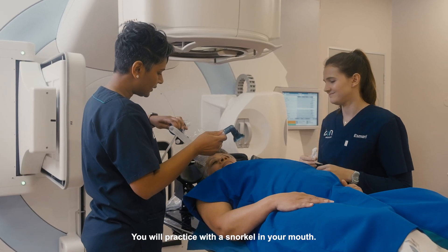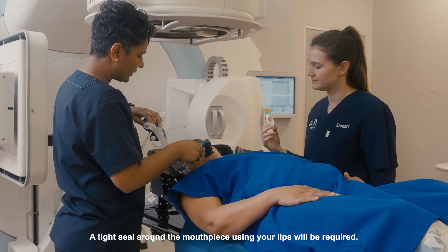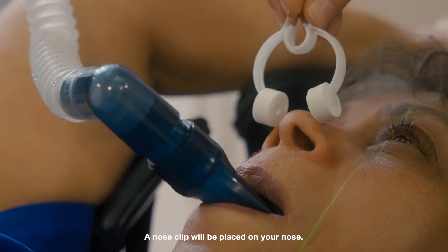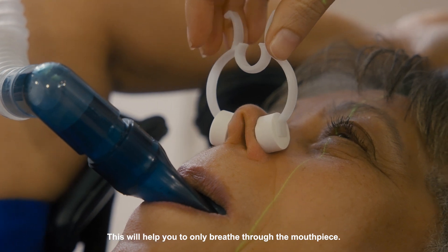You will practice with a snorkel in your mouth. This is a regular snorkel through which you can easily breathe. A tight seal around the mouthpiece using your lips will be required. A nose clip will be placed on your nose, which will help you to only breathe through the mouthpiece.